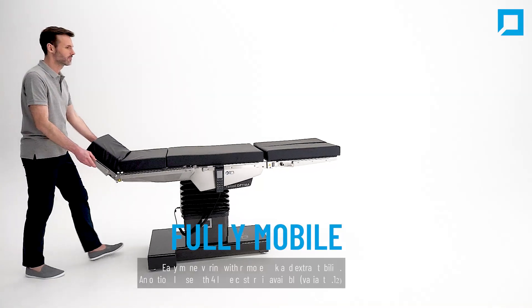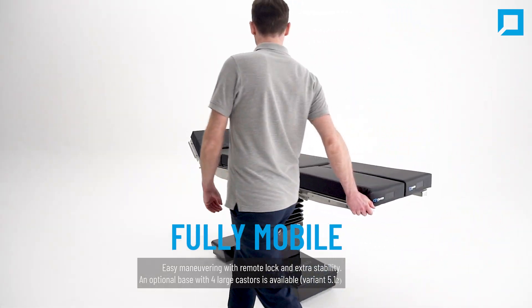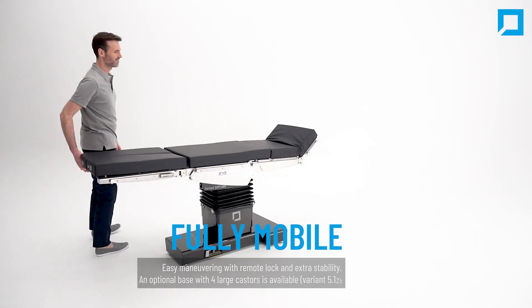It is fully mobile. Optima guarantees very easy maneuvering with a remote lock and extra stability. An optional base with four large casters is also available.